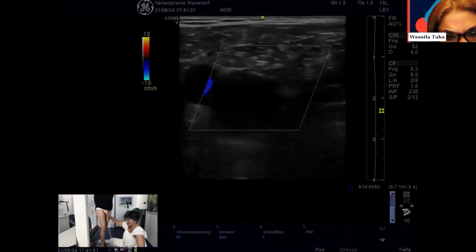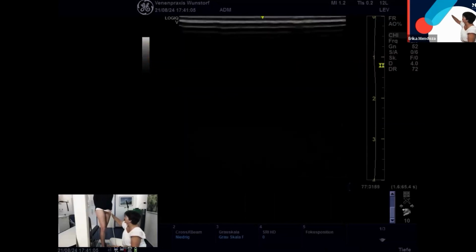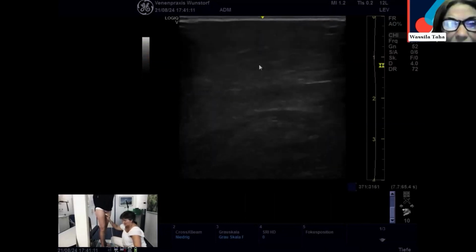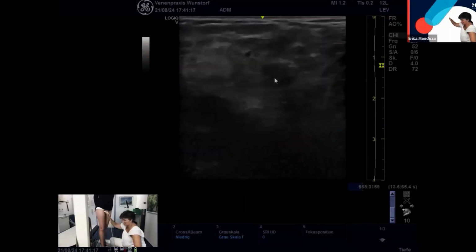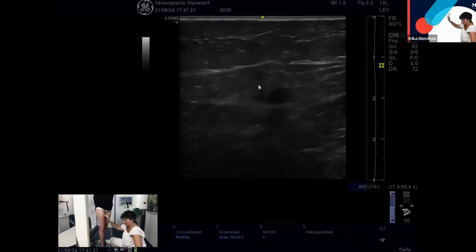Yes, this one. I think it's quite correct. There's a little bit of epigastric vein. Okay, so we look at the saphenous channel. What type of modality has been treated with surgery? Surgery, stripping. So we see no reflux.